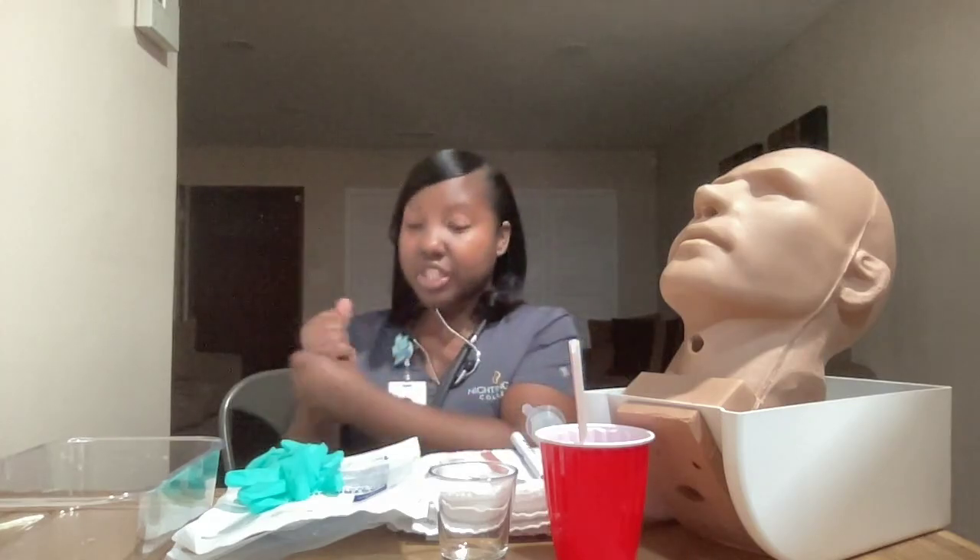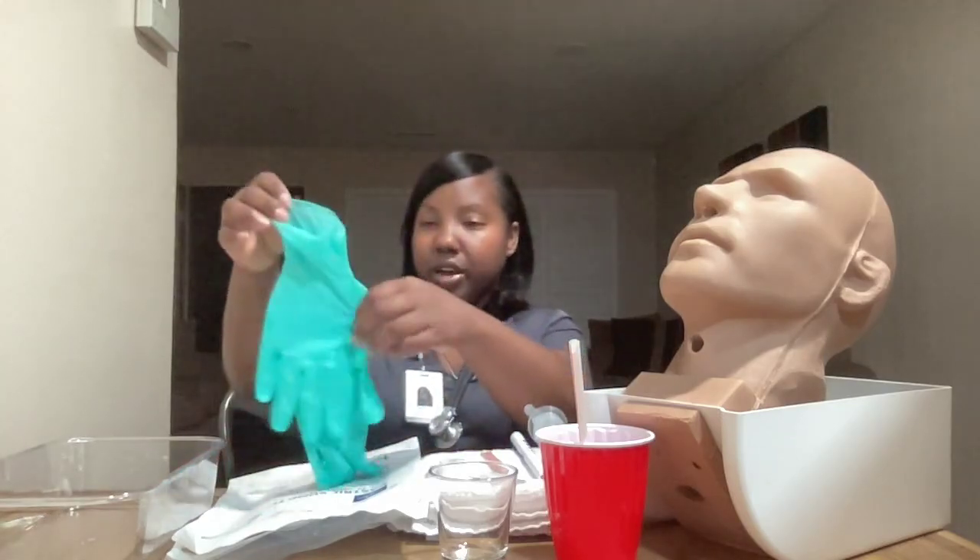I will begin by gathering my supplies and proceed to the patient's room. I will knock before entering and close the door or curtain behind me to ensure patient privacy. I will place my supplies down on a clean, dry, flat surface, then perform hand hygiene and place a new pair of gloves on.